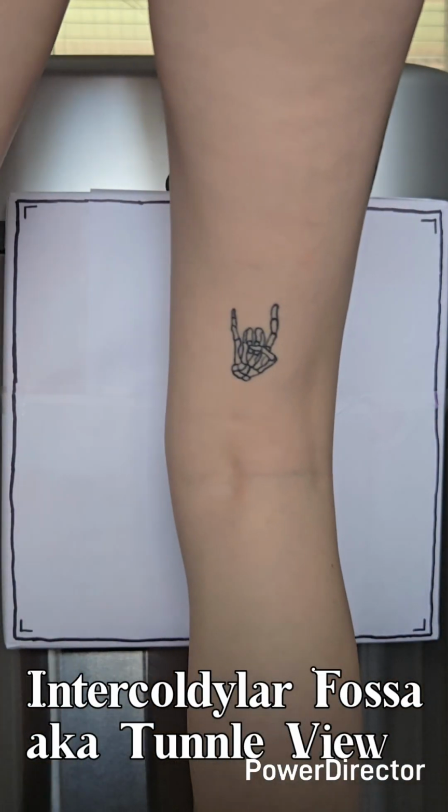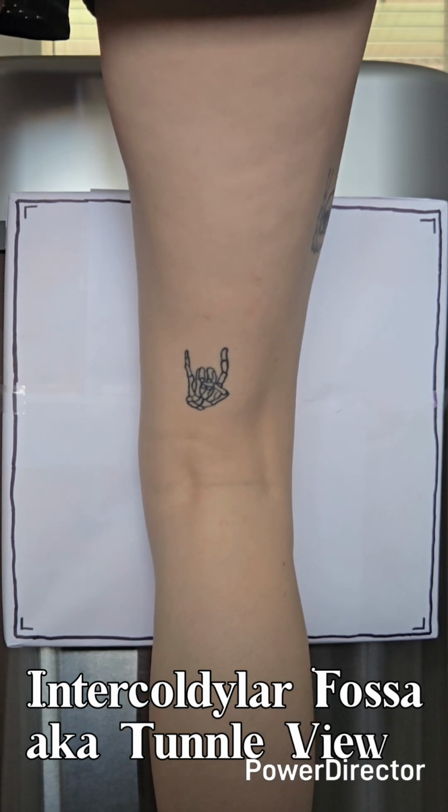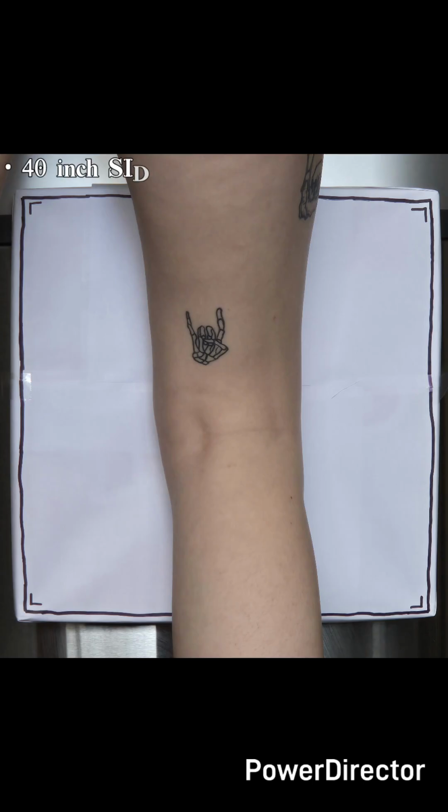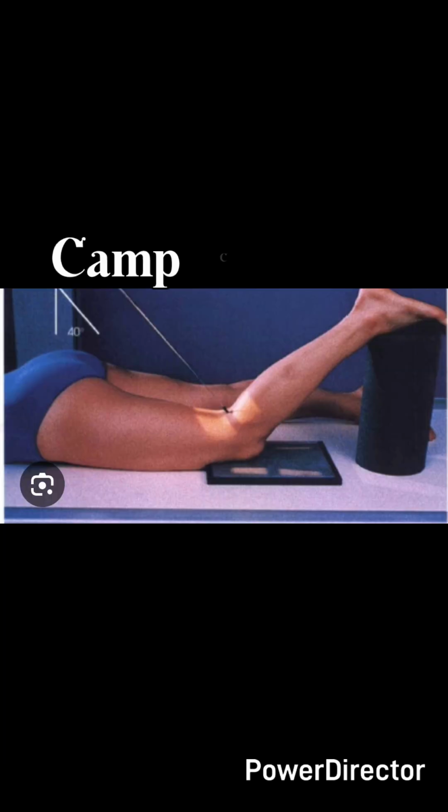And tunnel views, yay. So you're just going to match the long axis of the lower leg with your beam. You're basically just centering to the back of the knee, which I kind of pointed out here. And this is the Camp-Coventry method right here, which is pretty common.